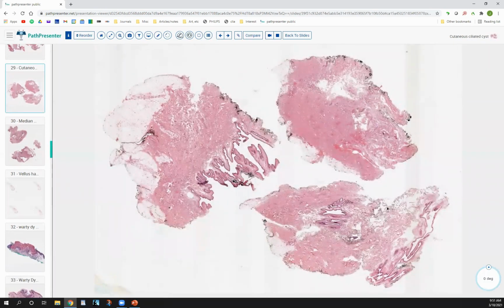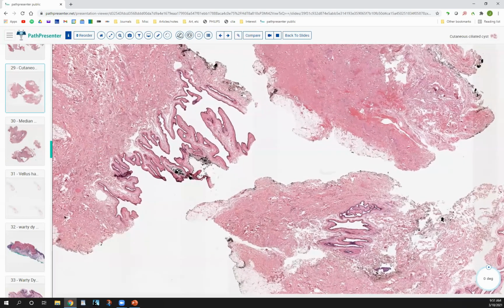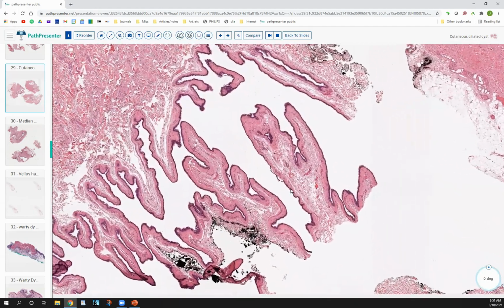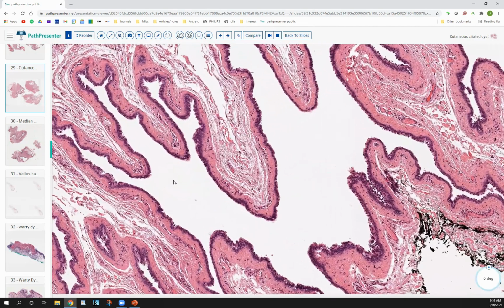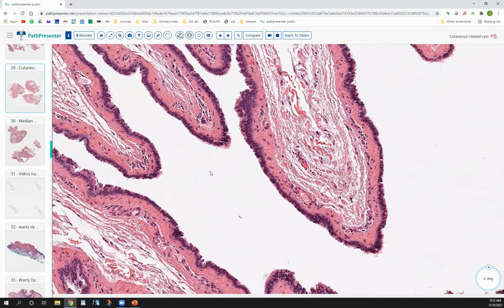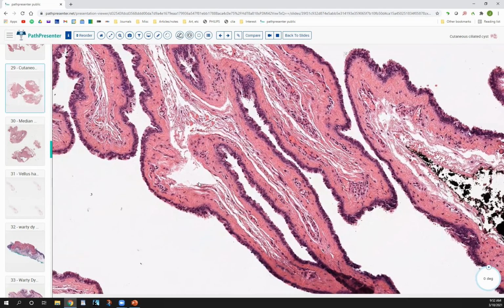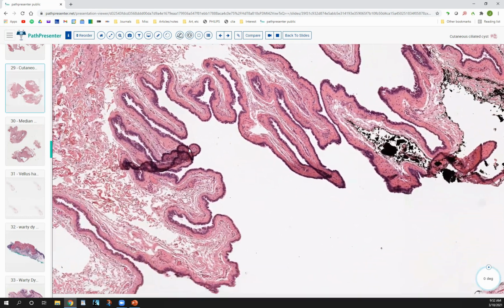Okay, so here's an even rarer one, a cyst. This is actually located on the legs, and often in females. Again, no contents, but similar sort of appearance to the epithelium that we were seeing in some of the other cases. This is pseudostratified epithelium, maybe a little bit of ciliation going on. As a matter of fact, this epithelium resembles a little bit of fallopian tube. So this is what's called a cutaneous ciliated cyst, and it's a very unusual cyst.